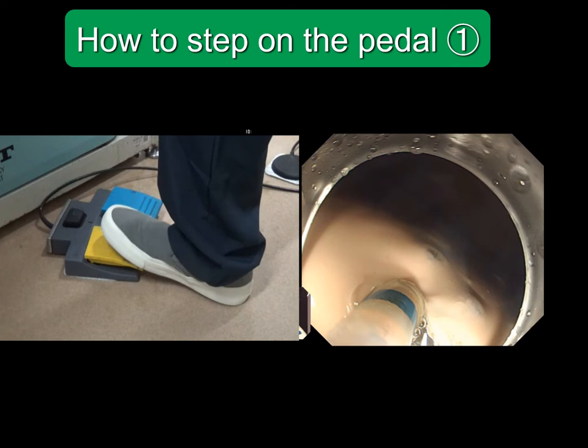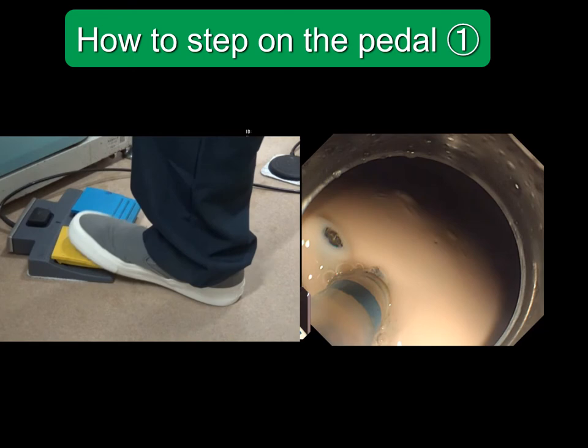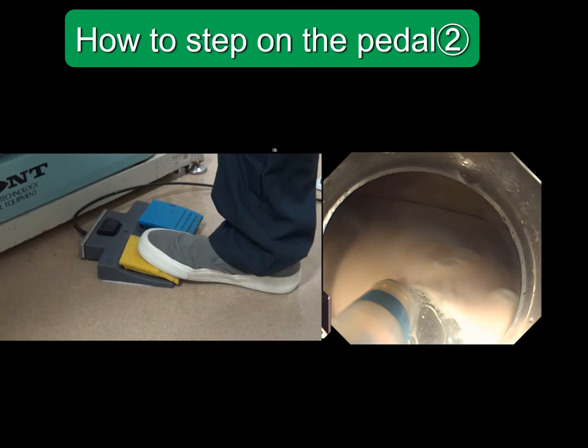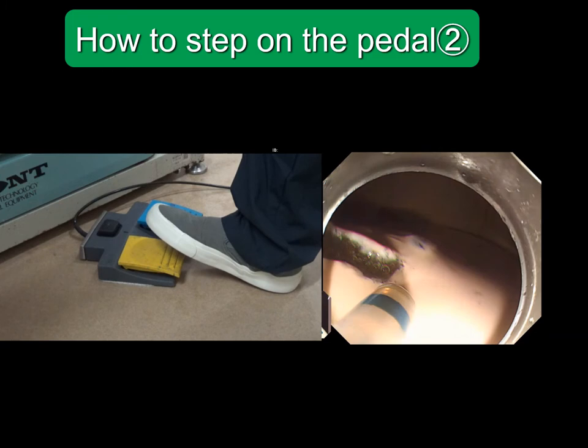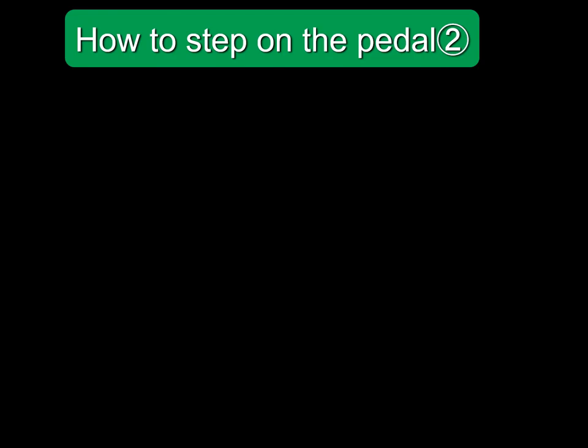I will show you how to step on the pedal. It is better to step on the pedal intermittently like this — this method is safe for beginners. It is difficult to control the knife if you step on the pedal continuously; this method is dangerous for beginners and I don't recommend it.